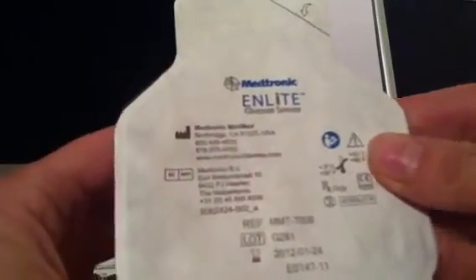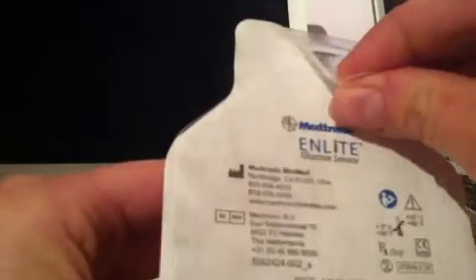So on the advice of my diabetic nurse, I insert these manually. I'm just going to show you what I do. I can't show you the actual insertion because my son is fast asleep, but if you're familiar with the n-light sensors you'll be able to figure out what I'm doing.